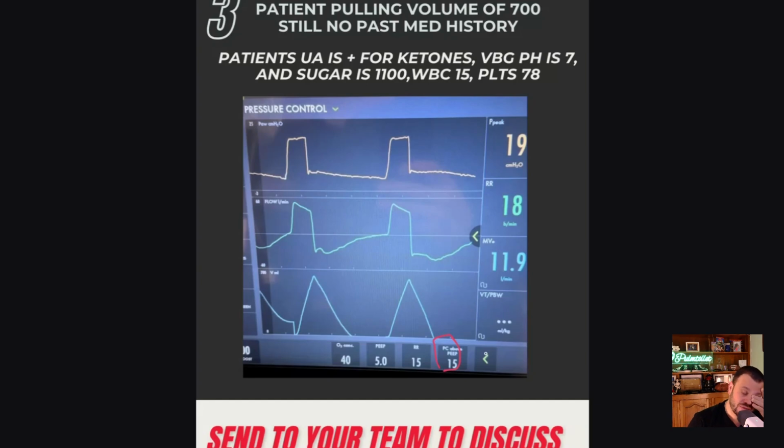If they're doing that, the thing you have to make sure of is that the patient is passive and the flow is getting to zero. If those two things aren't true, then the patient's plateau pressure is not what you think it is. Therefore, the delta P or the driving pressure isn't whatever you set. So that's the first issue.